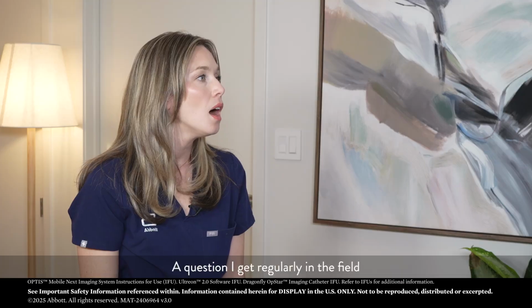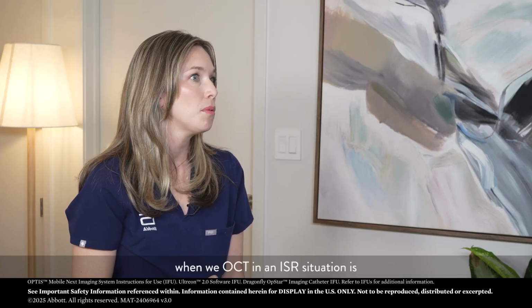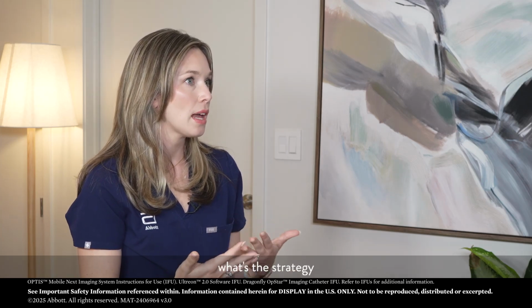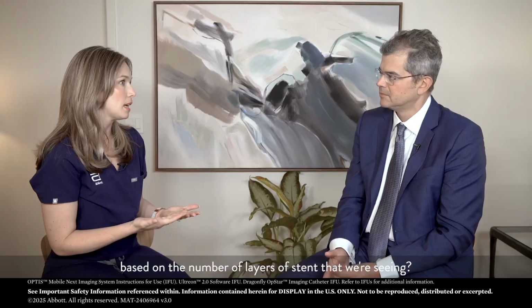Mm-hmm. A question I get regularly in the field when we use OCT in an ISR situation is, what's the strategy based on the number of layers of stent that we're seeing? Is there a magic number out there that dictates a particular treatment algorithm?